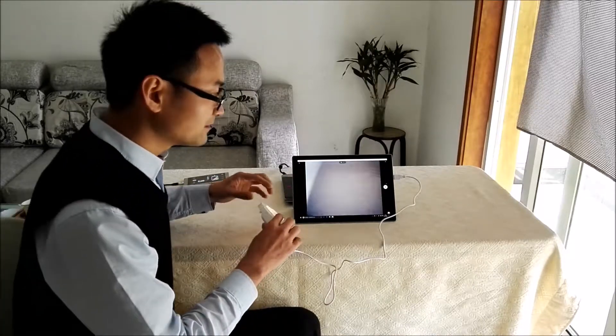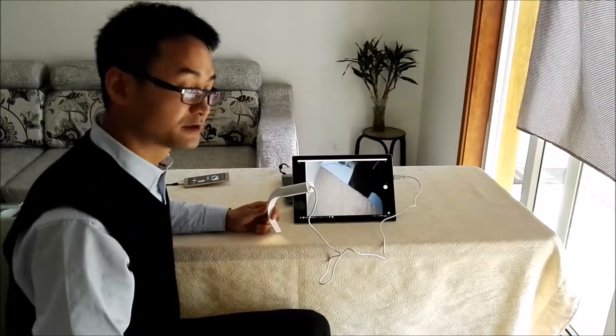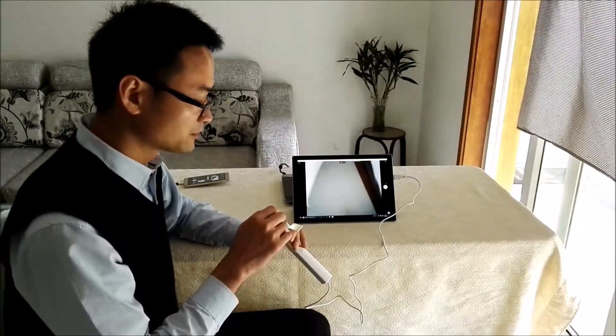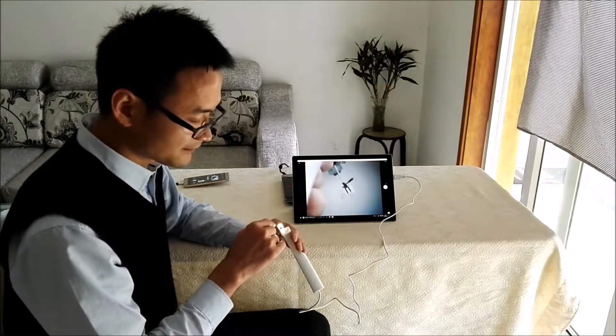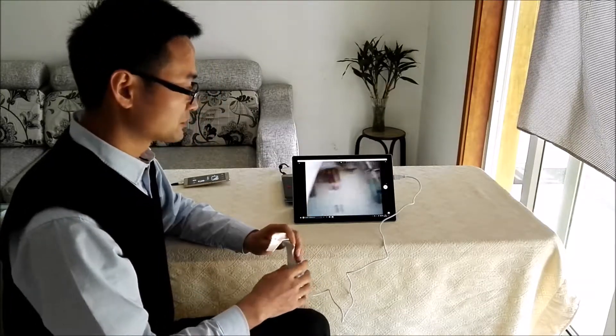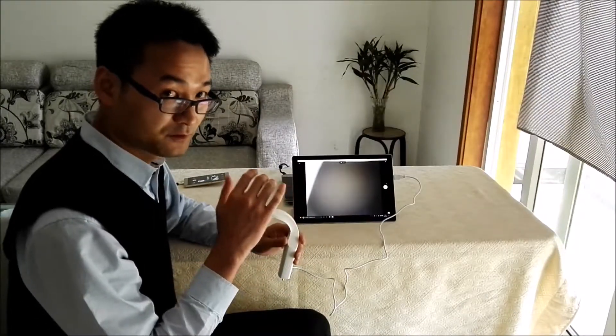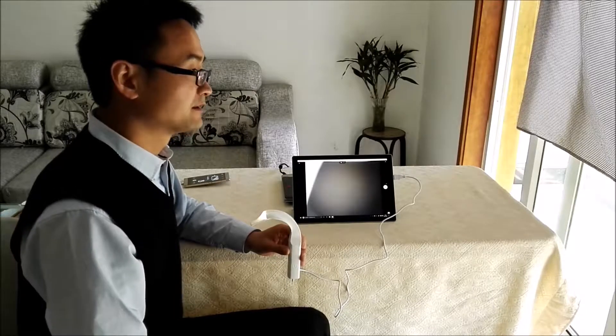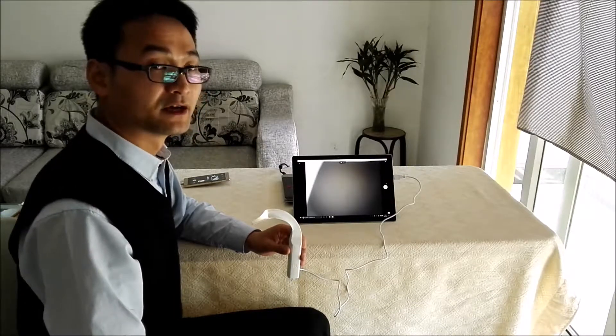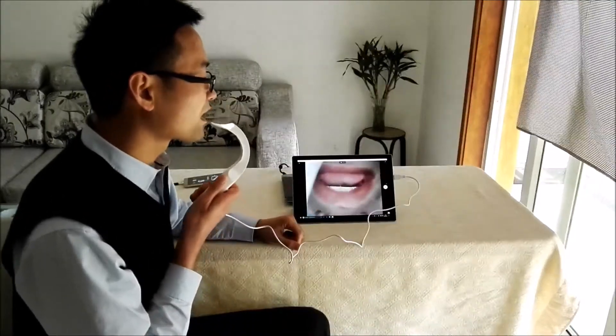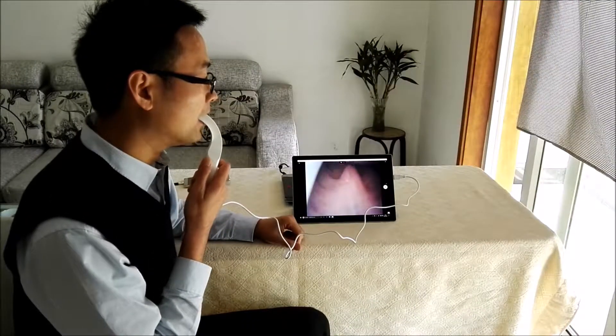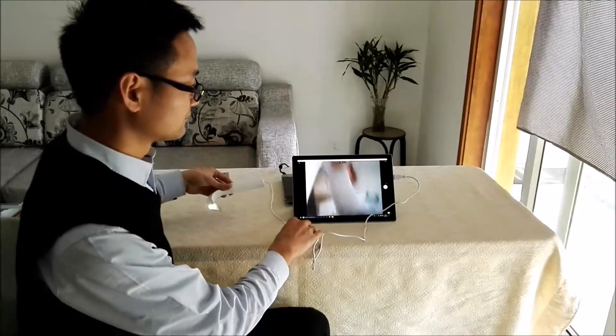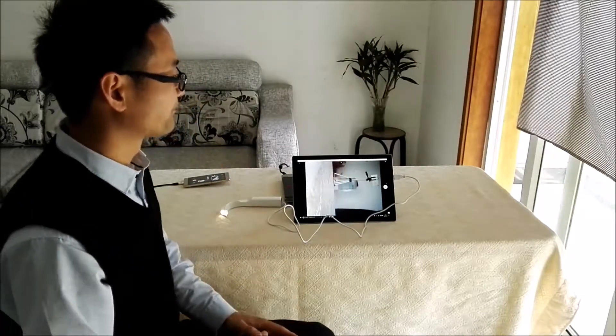The second point to judge a good video laryngoscope is defogging. We make a special coating on the lens so it can prevent the fogging. Today is April 21st in Beijing, the temperature is still lower than the operation room. I'm going to show you. Okay.